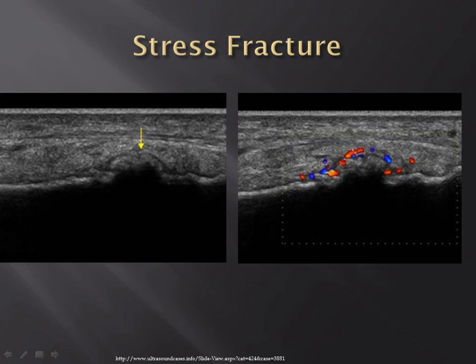It's amazing. Sometimes you'll ultrasound a chronic tendinopathy and you'll see pretty extensive echogenicity and shadowing from small calcifications deposited within the tendon, which have either little or no radiographic correlate. And so ultrasound can pick up those changes before you see them on radiographs, similar to what you would see in breast imaging as well.